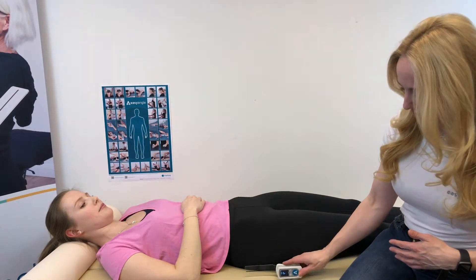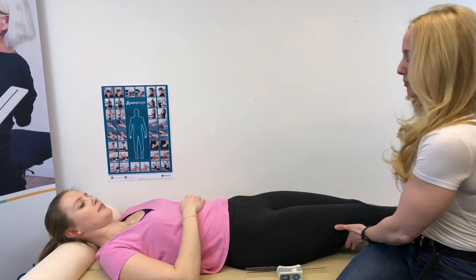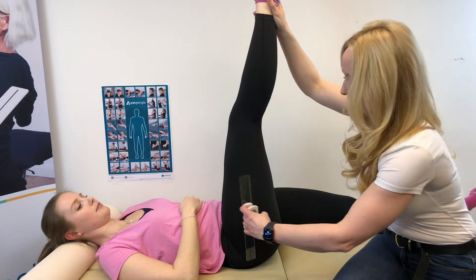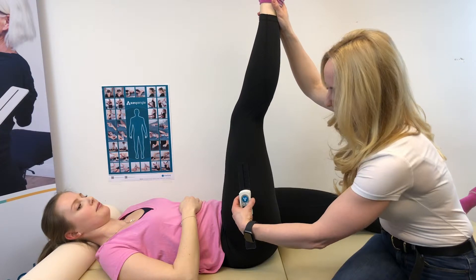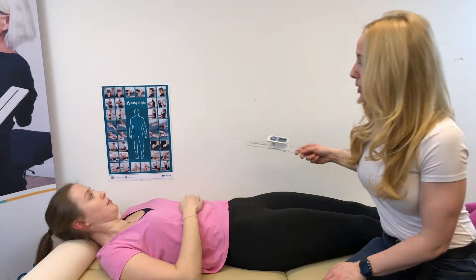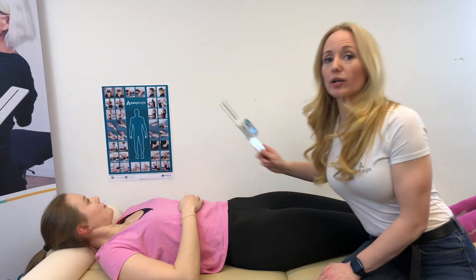We place it against the bench and zero it on the bench. Then we take the leg and bring it into maximal flexion, making sure to keep the base of the ruler in line with the hip as we bring it onto the side of the leg. We press the button and we get our measurement. This is demonstrated in the poster in the middle at the bottom.